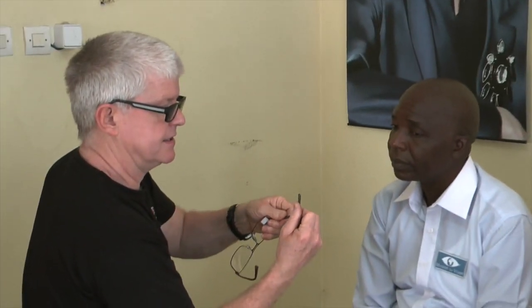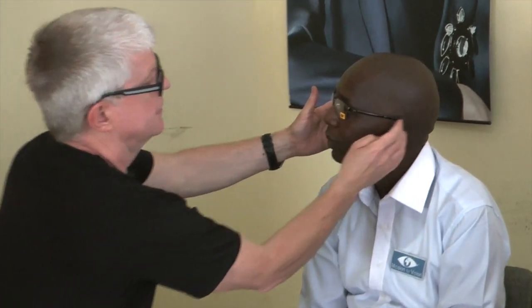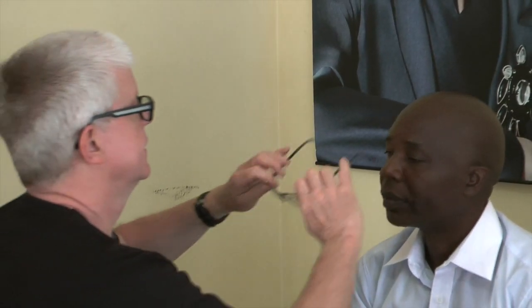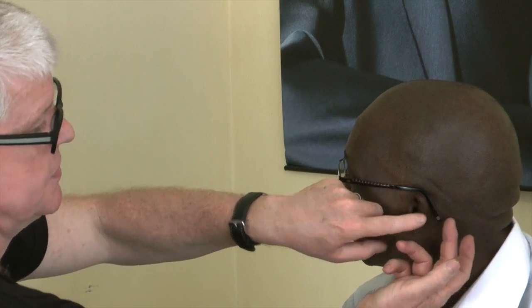If you face the camera, Remy — you'll see the side is not flat against the head, so that is too much. So you bend it just a little bit and there we have the correct fitting. If you have it too much the other way, again it won't be very good — it's sticking out, and that will rub on the ear sometimes. So that angle is another thing that you must consider when fitting the frames.